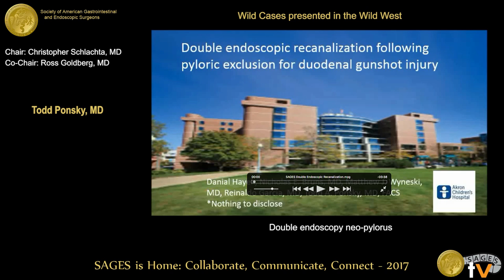He actually had a CAT scan done, which showed evidence of a vena cava injury, but he had a hematoma, so they transferred him to us, and he was stabilized, taken to the operating room. We did a laparotomy, and let me talk about what we found, and we'll stop it and see when people would have done things differently.